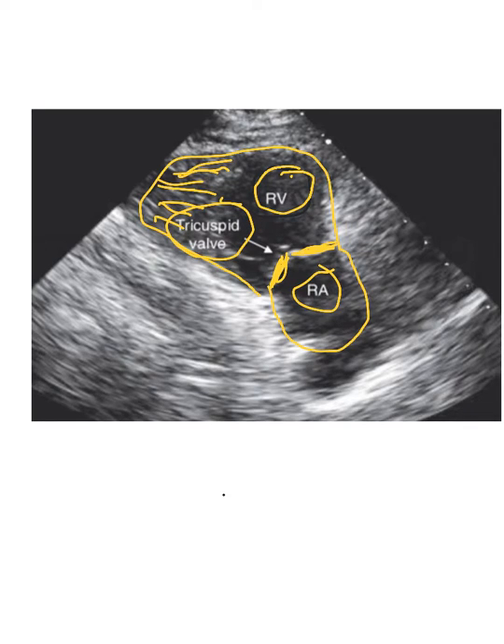One of the reasons why this is a good view to sample the amount of tricuspid regurge is because when your continuous wave pops up, you can run it right through the tricuspid valve when it closes. That'll give you a real good sample volume of how fast the tricuspid regurge is going — is it 3 meters per second, is it 4 meters per second? The higher it goes, the higher the pressure is. You want to make sure that you get a good sample of that.